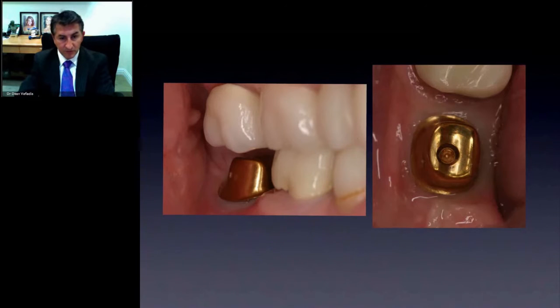And so something like this, where you have an ideal contoured crown that really, really supports the tissue. We're going to talk about how that tissue is supported, as opposed to a prefab abutment that may be very small and not supporting the tissue. The biggest complaint that we have is that food gets caught between these areas. So by extending the design of that abutment and making it look like a molar, it actually decreases that food impaction, and now the position of the implant that has been replaced is a much more lifelike size of the tooth.